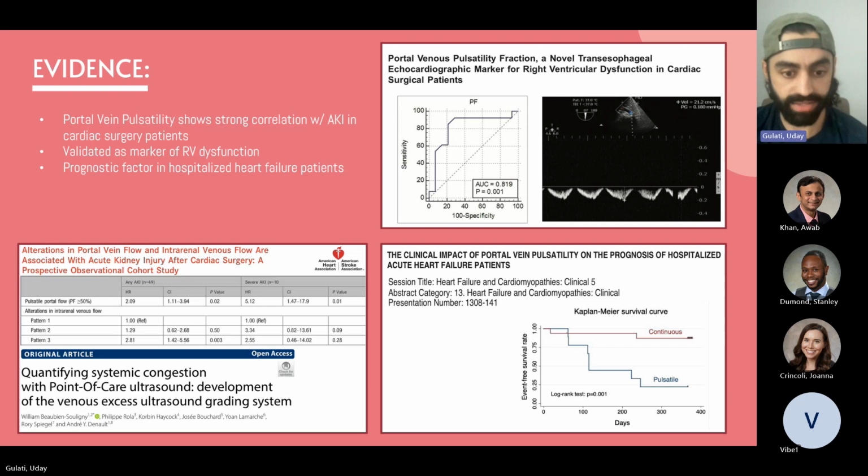And there's a really nice trial that I'm pretty excited about that should be coming out later this year called the Andromeda VEXUS trial that specifically looks at venous congestion in septic patients. Because you think about modern day medicine, there isn't a worse way to try and resuscitate a patient than by using a simple equation standardized for every patient.